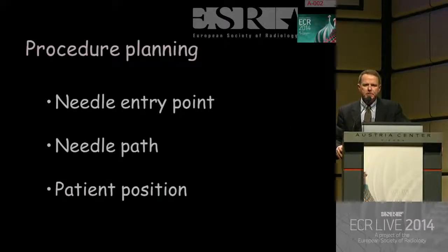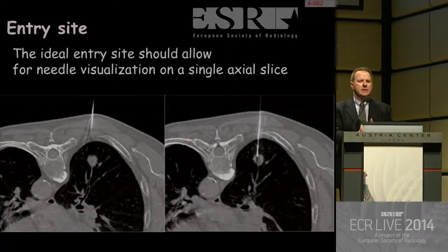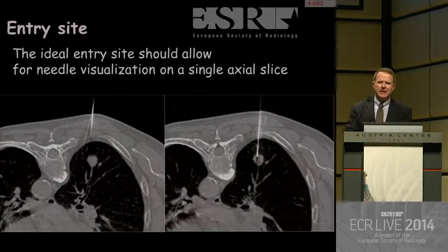At this point, you can plan your procedure. It's about time. So you have to decide, where do I enter? Where do I go through? How do I put my patient? Why is patient positioning so important? Well, patient positioning is important because it's about everything.